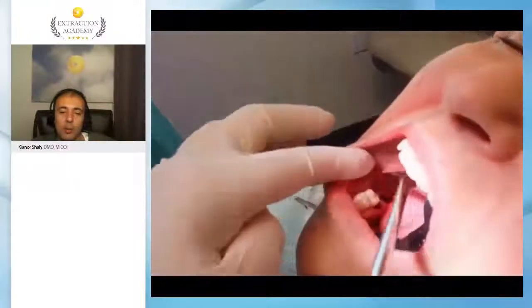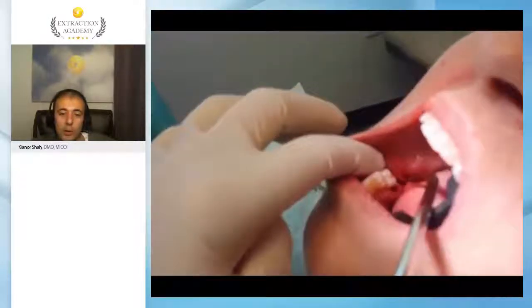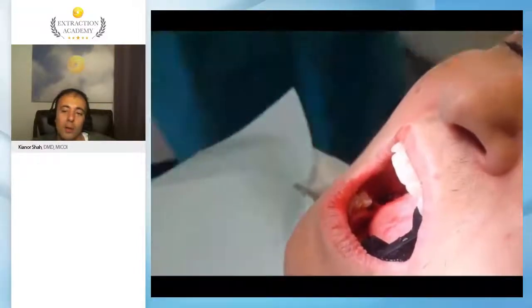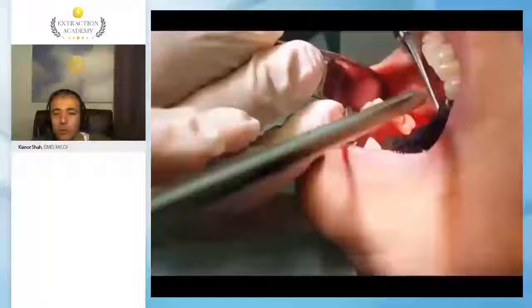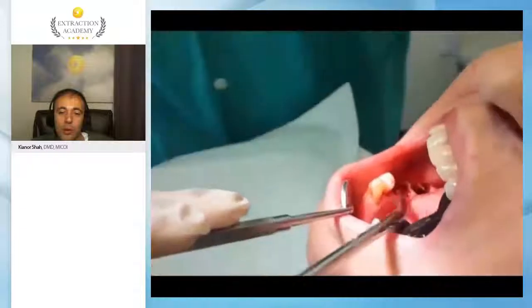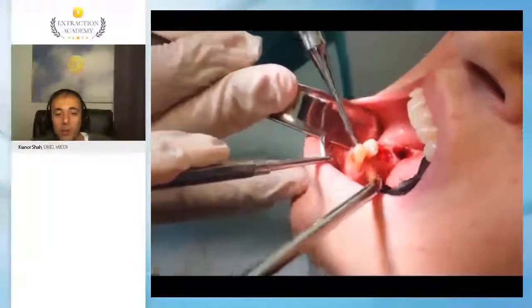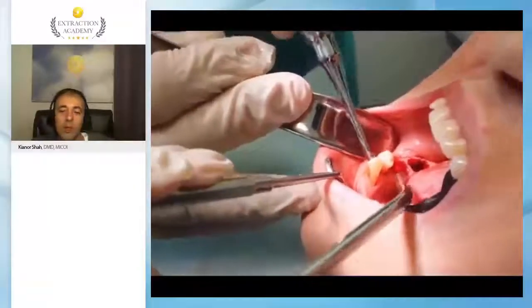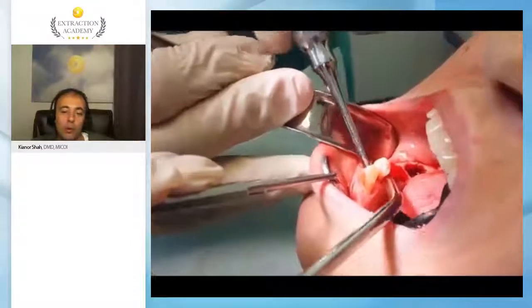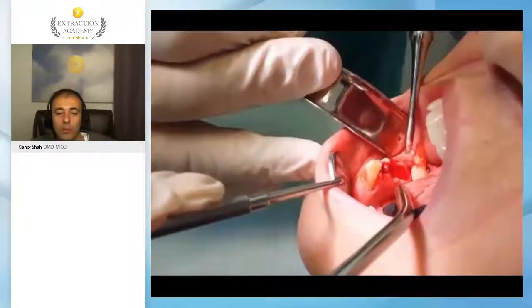But you see that we have broken out a mesial root, and this is where our colleagues start getting into concerns that, okay, am I going to be able to find this thing? Am I going to be able to trough it? Do I end up having so much root left at the bottom, like in this case where you see the tip of the root still broken, that I have to go back and chase it? This was a good case because the teeth were really brittle, and the patient was an older patient, and it was quite challenging. So in the course we will go through how to recover those roots, how to follow up with radiography, and what to look for.